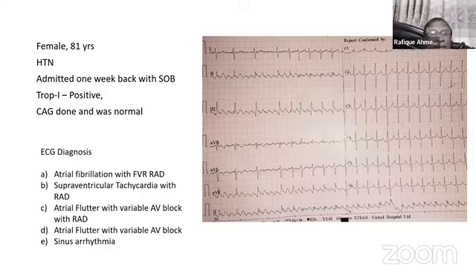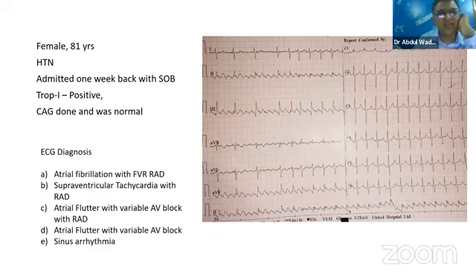Anybody else, any comment? Wadud? The beauty of this ECG is the baseline. As you always say, ECG interpretation is actually pattern recognition from your memory bank of pictograms. That appearance should always be kept in our mind, fixed in there. Whenever we see this type of sawtooth, it's atrial flutter unless proved otherwise. The point is whether it is regular, 2:1, 3:1 block or irregular block. This is another matter. That's the thing I would always ask our students to do.